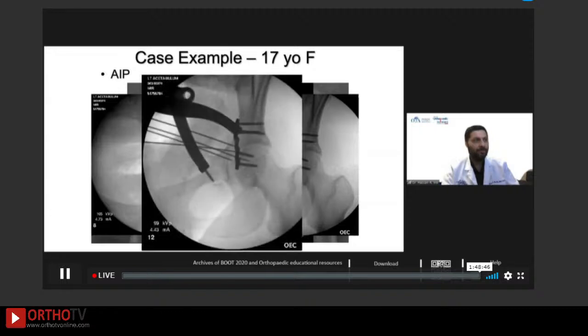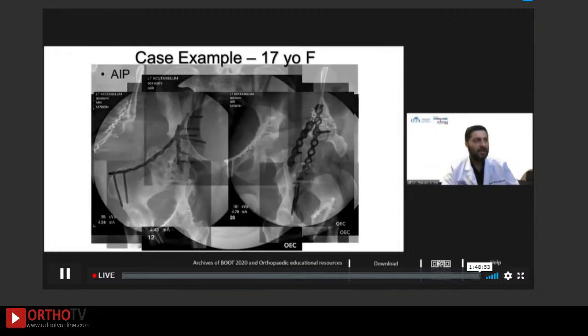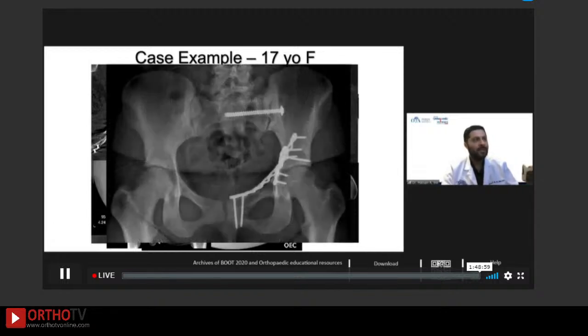And then we went on to be able to address the low anterior column portion of the fracture and got it reduced and buttressed. And then here's her postoperative CT scan showing good alignment. She also had an iliosacral joint injury on the same side. And then here she is healed at a year.